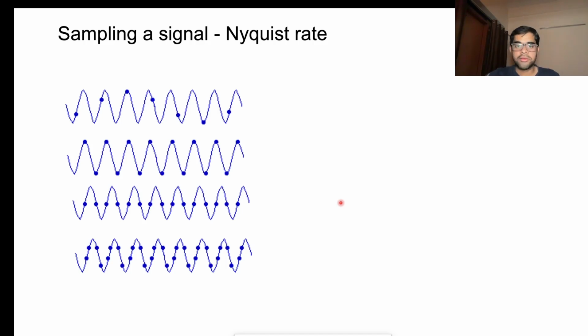It was just one small follow-up question. Talking on the phone, let's say, they need to sample at least at 2000 samples per second. Correct. But the actual signal might have many more samples, maybe 5000 samples. Yes, you can have more. Then does increasing the sampling frequency further lead to a cleaner, more audible signal, or is it just the same?